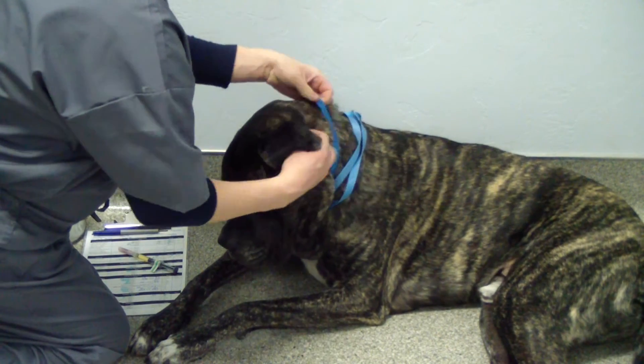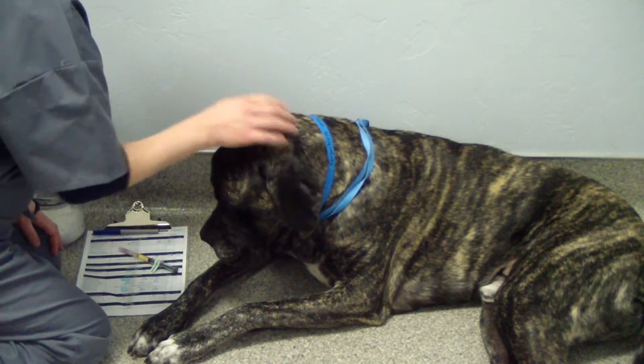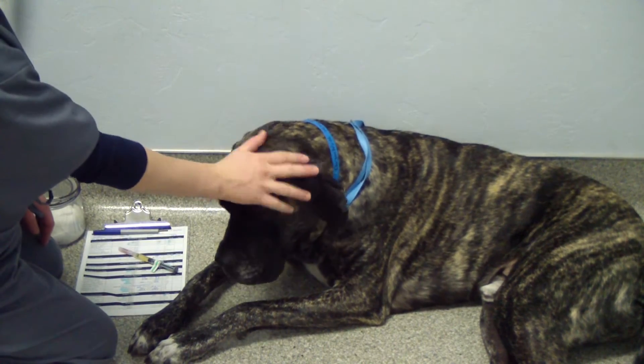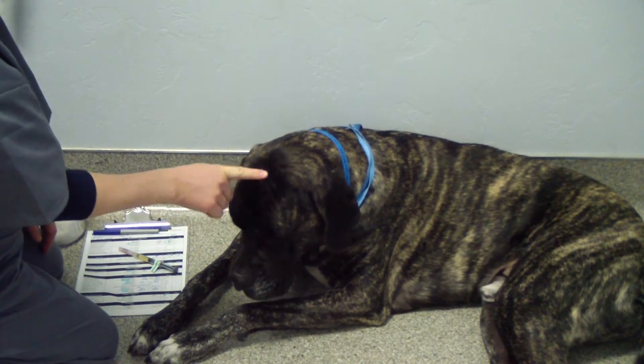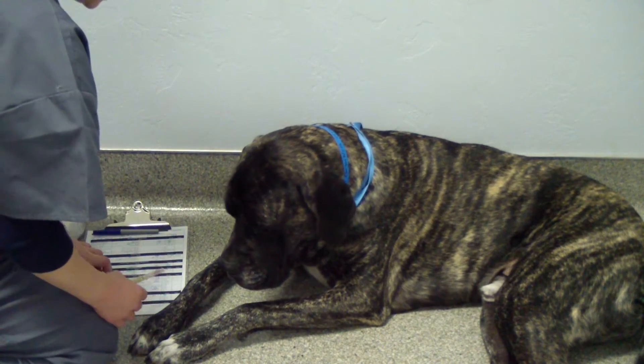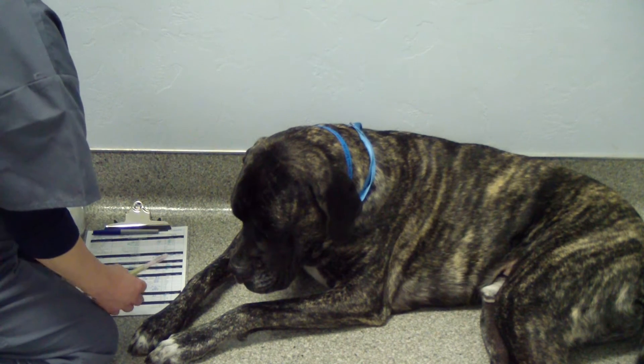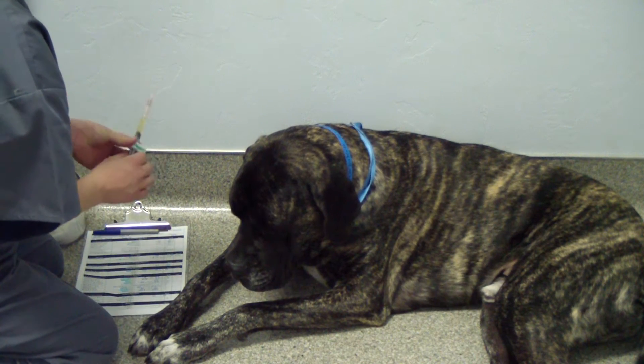Our patient is Gorgon Wirth. He just finished surgery, so we want to make sure his temperature is at least 98 degrees before we give our sub-Q NSAID pain injection, or analgesic injection. The chart says Gorgon on it.